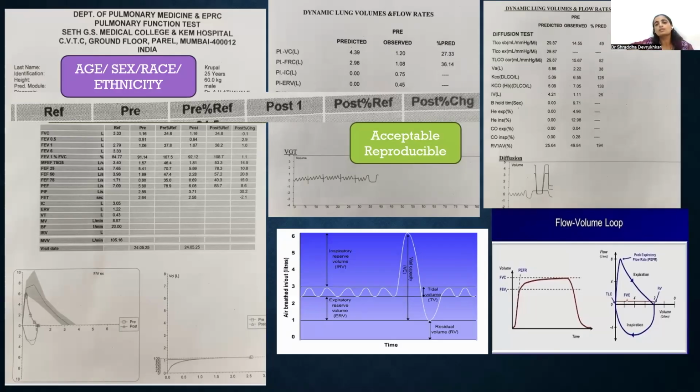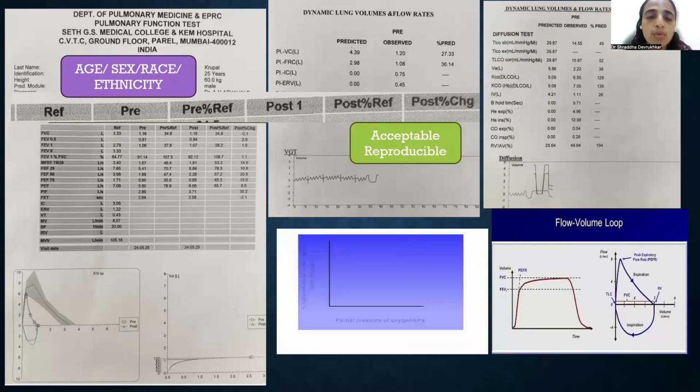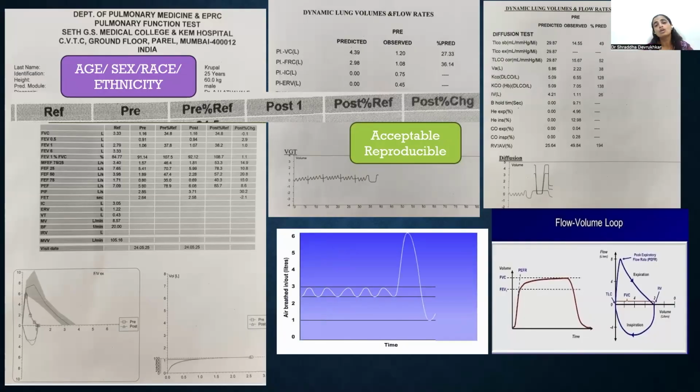And even if we can compare these things and not go into the depth, just looking at the graph tells you many things. Initially we were doing PFTs in terms of FEV1, FVC, where we are expiring; forced expiratory volumes were taken. But nowadays we also commonly do your total lung capacity, your FRC, or the expiratory reserve volume by body plethysmography, which works on your simple Boyle's principle.